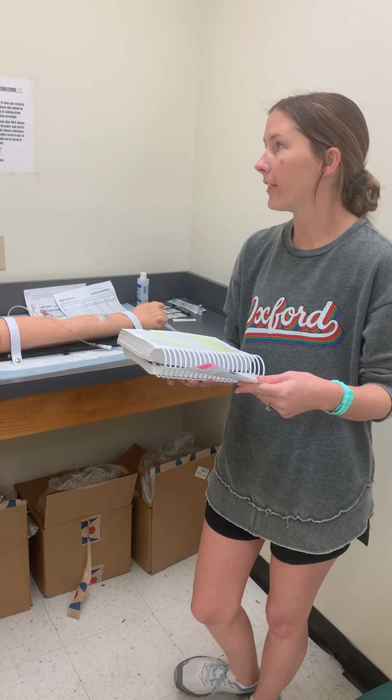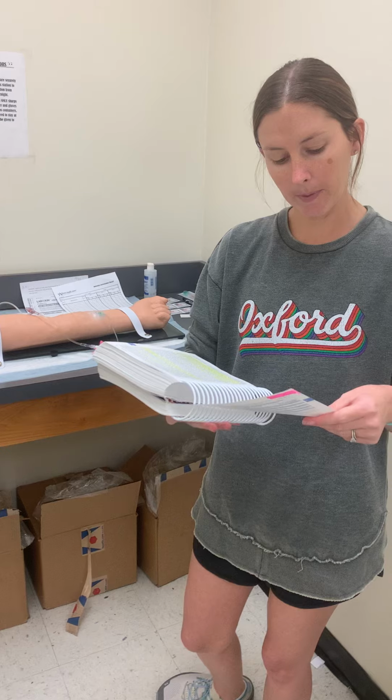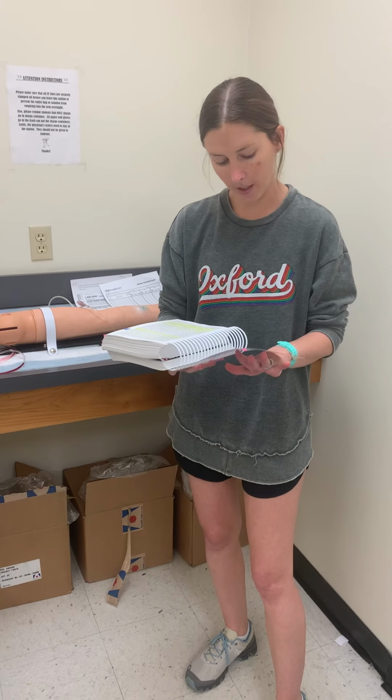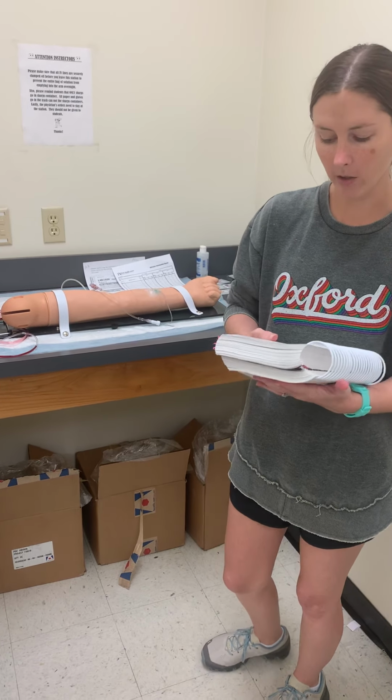Or it says each 1 milliliter may be diluted in 4 milliliters of sterile water, normal saline, or D5W. So we have D5W hanging, so we know that it is compatible with what we have hanging, so we can use it to flush. The rate of administration of this medication, it says each single dose needs to be given over a minimum of 5 minutes.